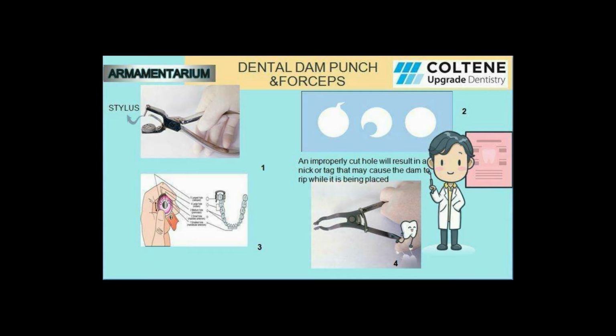And the very next picture, or the fourth picture, shows the rubber dam forceps. These forceps are required for placing the rubber dam clamps from the organizer onto the tooth.